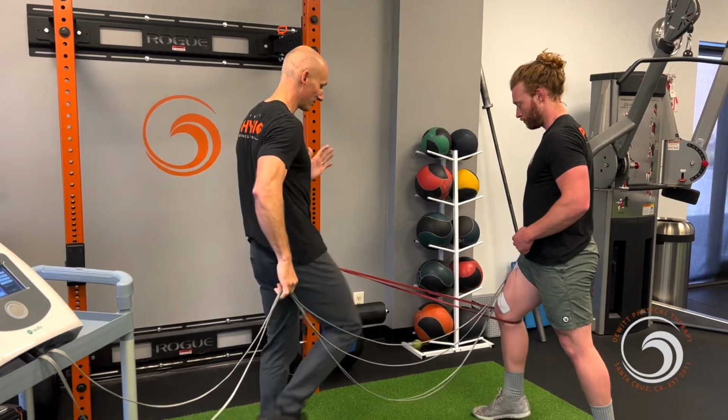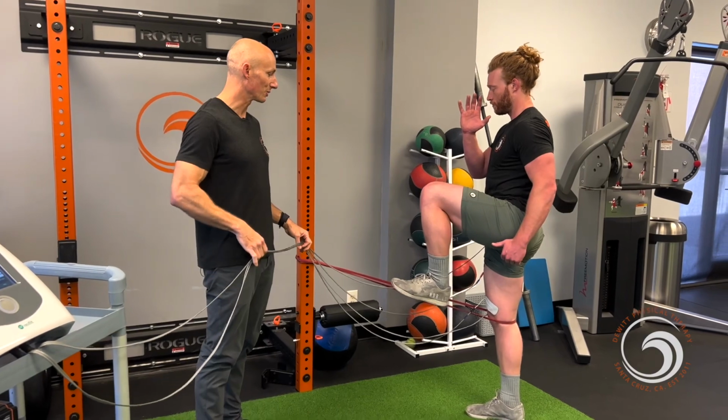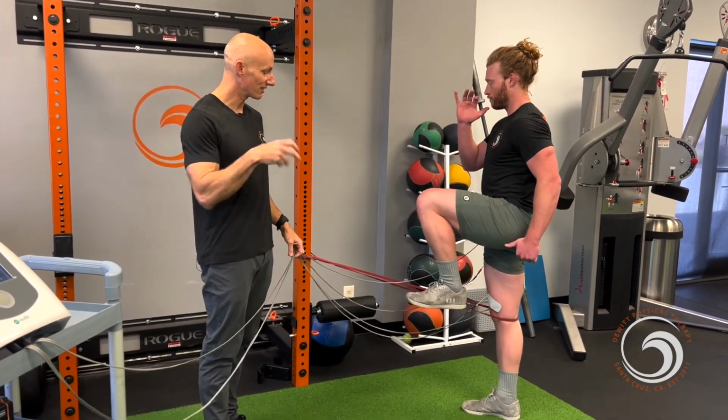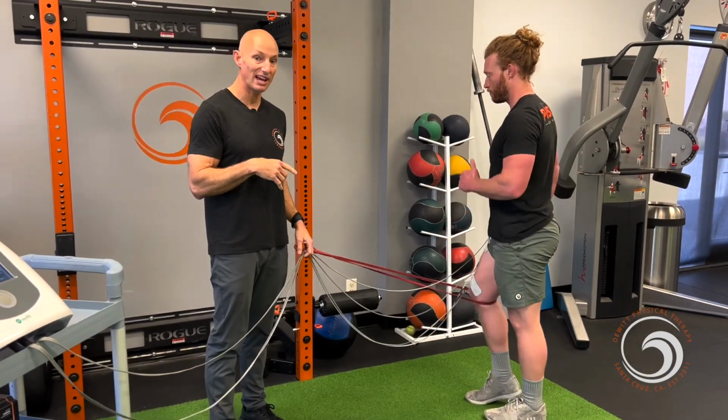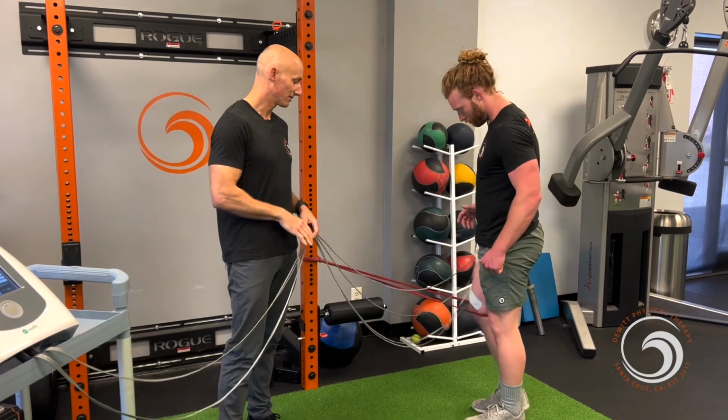Great, now go ahead and go into a single leg stance weight shift and then give me a march. So now we're really syncing that anterior chain and posterior chain, plus all the stimulation that he's getting through those pads is increasing his proprioceptive awareness at the same time. Great, come on out of there.